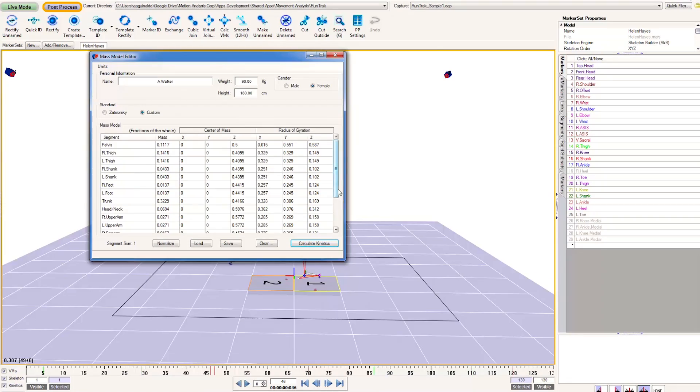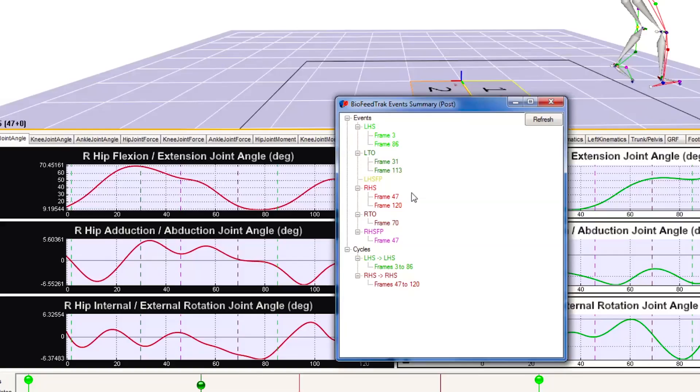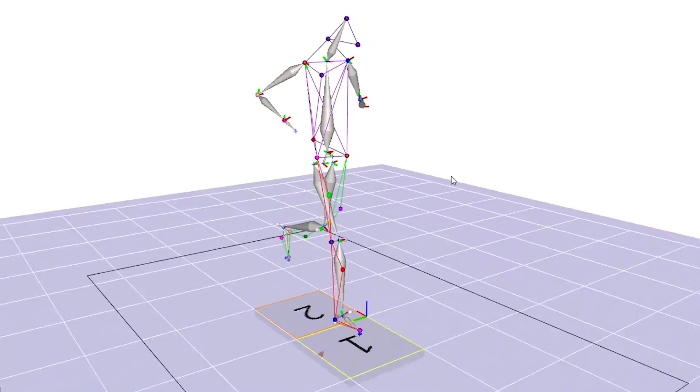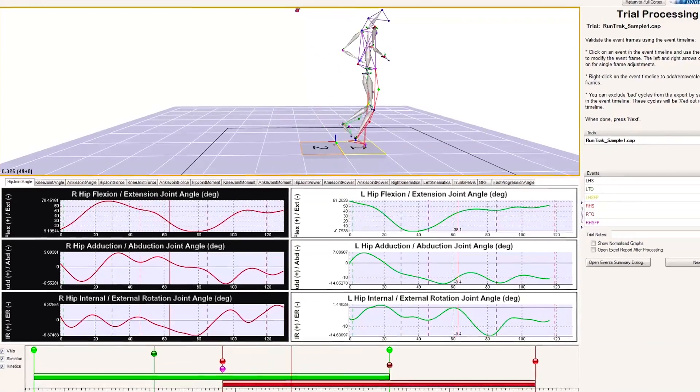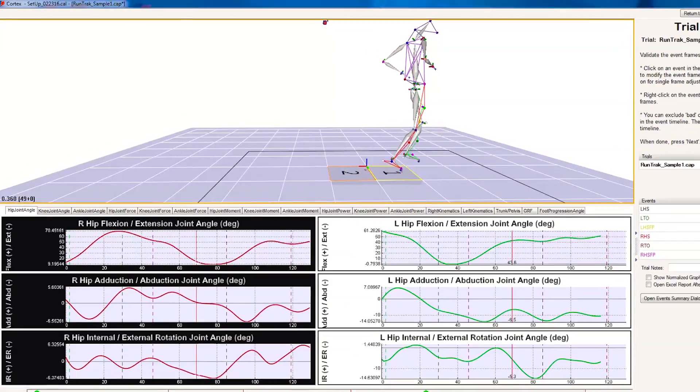RunTrack is essentially the same thing as GaitTrack, except it's for running. It's more for the athlete or coach that wants to look at someone's running mechanics and perhaps assess the risk of injury at the foot and ankle or at the knee.